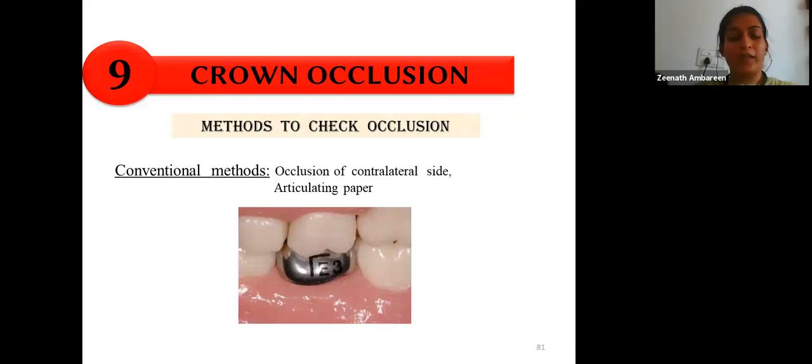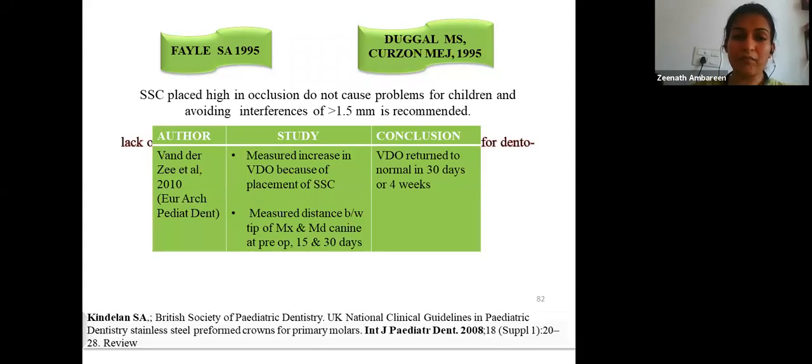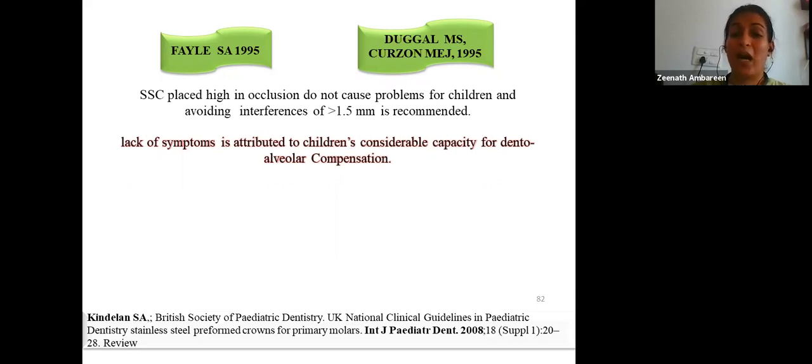After cementation, check occlusion by comparing with the contralateral side or using articulating paper. If the crown is placed slightly high, this generally does not cause many problems in children because occlusion tends to settle down within about 30 days, but interferences greater than 1.5 mm should be avoided. The lack of symptoms in children even when the crown is placed high is attributed to children's considerable capacity for dental compensation.